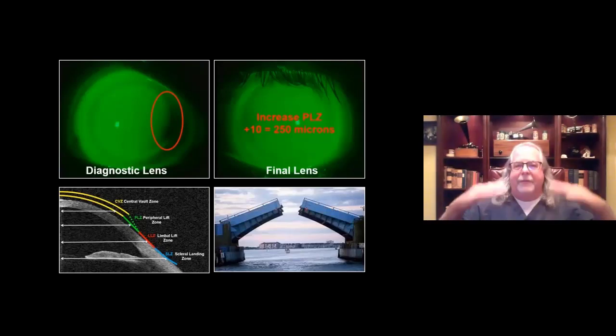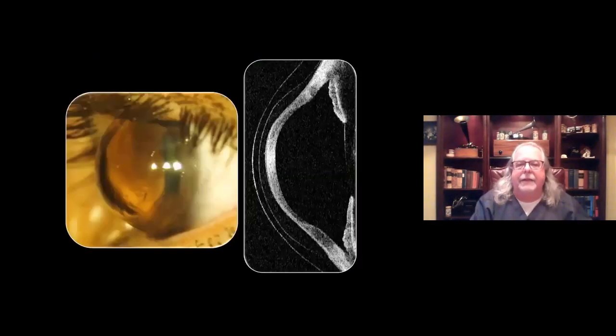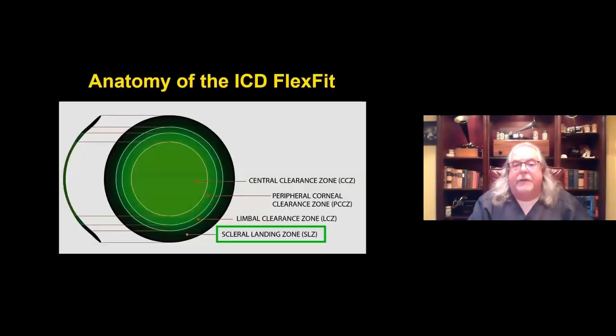I'm constantly doing this in practice to really get my arms around what is happening clinically. And here is this particular patient in OCT imaging, and sure enough, you can see that we've created the desired clearance we're really looking for in this particular patient.